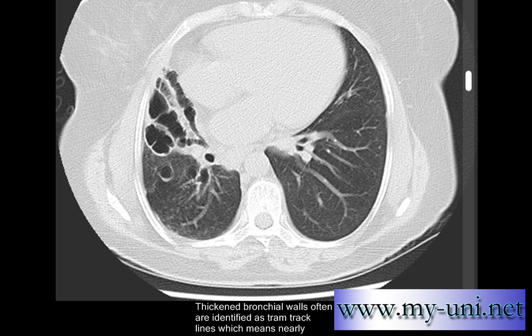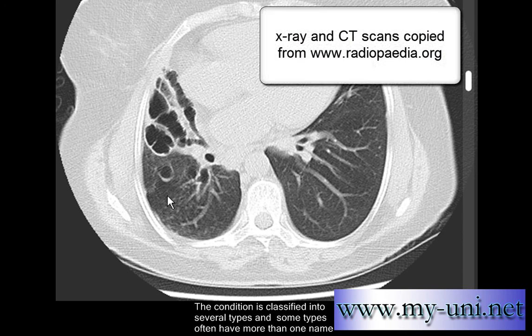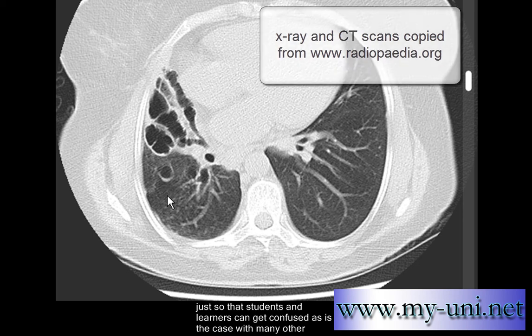Thickened bronchial walls are often identified as tram track lines. Here is a good example — this tram track line shows nearly parallel walls instead of tapering down towards the end. The same applies here; this is a huge bronchus.